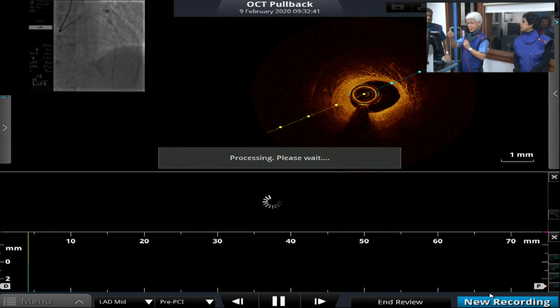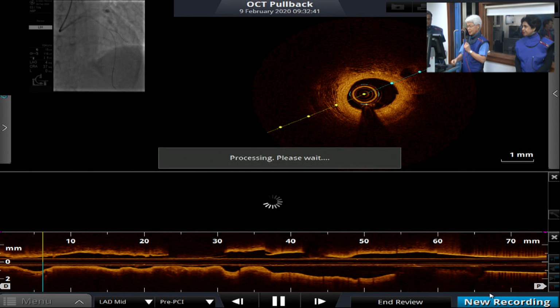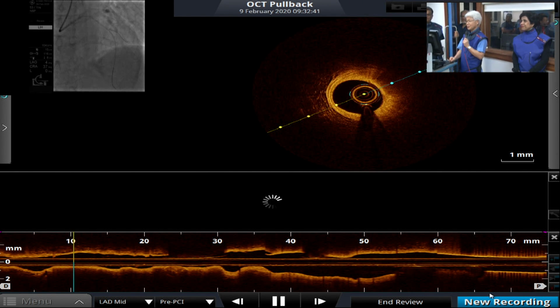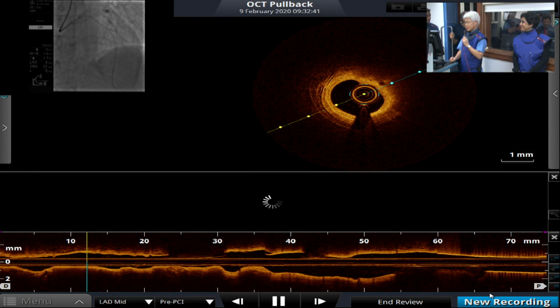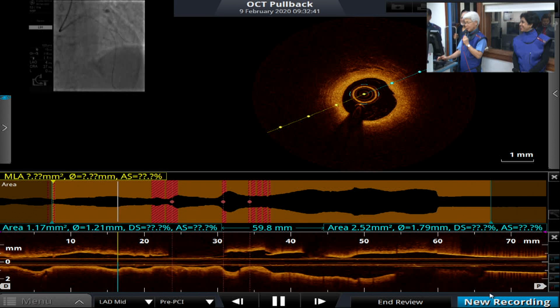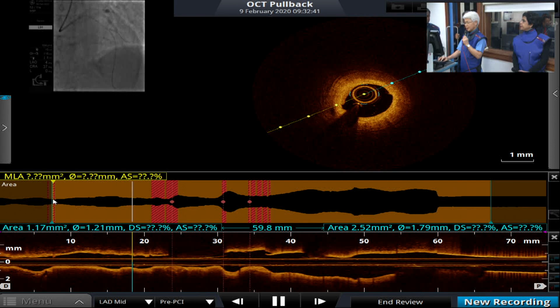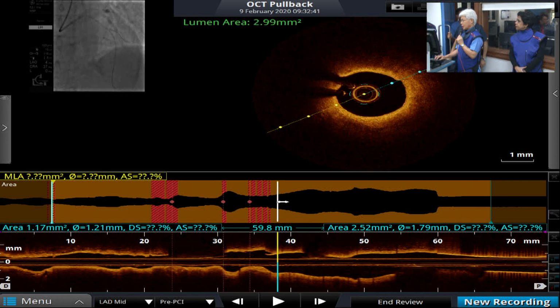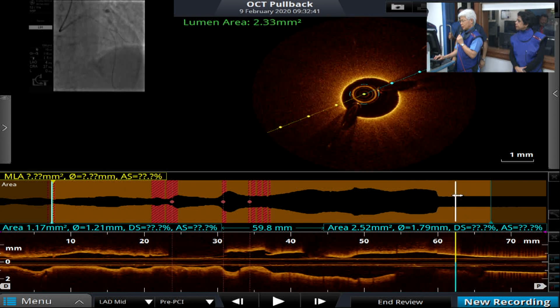Okay, take out the catheter. Yeah, back. Very wonderful image. It could not be otherwise with the team that I have here. Can you see the OCT image? Yes. Okay. So we try this, remove the catheter? Yes, I always check.